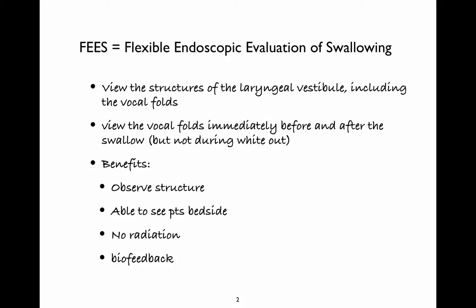You're able to see patients bedside, so you are not in a medical center restricted to those patients who are healthy and who can be shuttled down to imaging or radiology. You can also take a small FEES unit with you to other locations other than a hospital to do your assessment. So people in a skilled nursing facility can be evaluated.